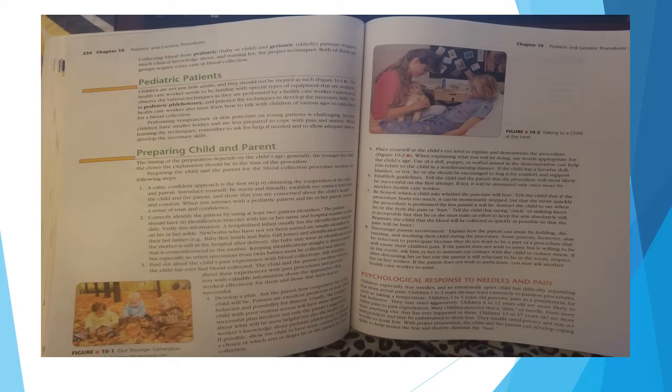Tell the child that saying ouch or making faces is acceptable, but that he or she must make an effort to keep the arm absolutely still. Reassure the child that the blood will be collected as quickly as possible so that the pain will be brief.